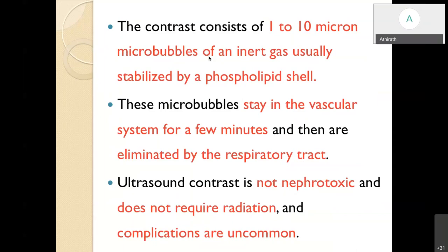So these microbubbles will stay in the vascular system for a few minutes, and later they will be eliminated by the respiratory tract. The advantage of ultrasound contrast is that, unlike CT contrast, it is not nephrotoxic. It will not require any radiation, and complications are highly uncommon.